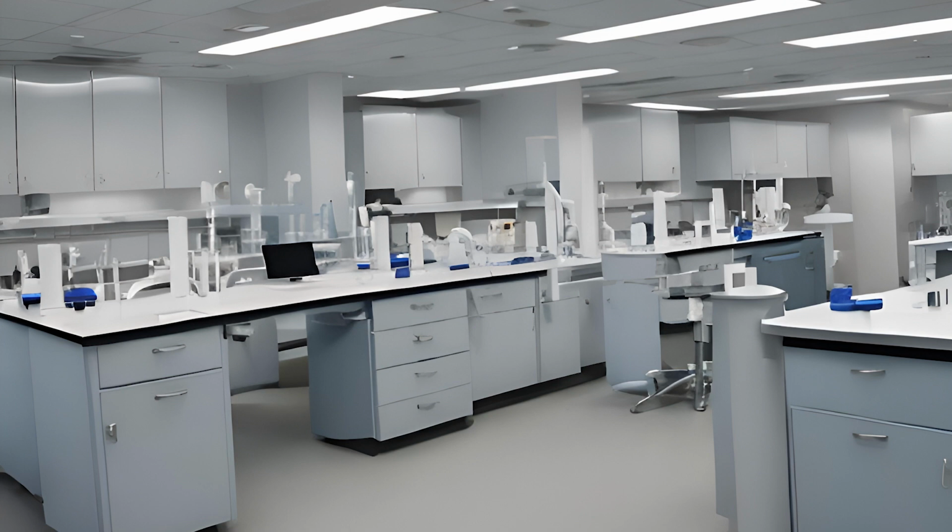The person needs to see that their blood has their label on it so that they know with certainty their name is attached to their sample and that the results they receive belong to them.